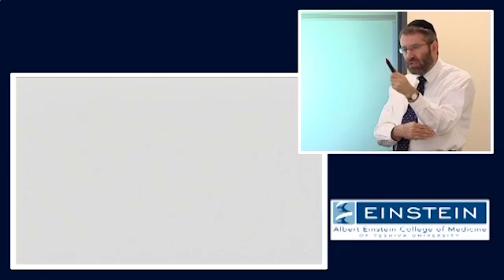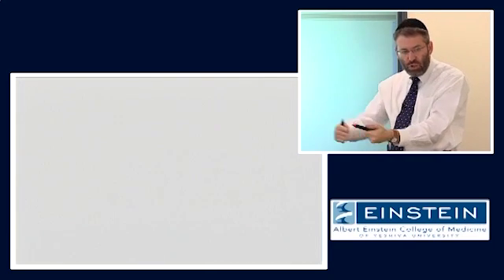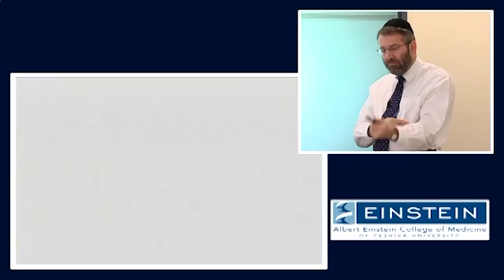Now, it turns out that if the TR is extremely long, in which situation will we have a higher steady state magnetization? When we rotate our magnetization 45 degrees, or when we rotate it 90 degrees? If the TR is extremely long, meaning we allow this to recover all the way after every TR. 45 will have a larger amount of transverse magnetization? No, less. Will have less, exactly. So my question was, which one will have a larger steady state signal? Right? So 90 degrees, when the TR is long, will give us a greater amount of steady state signal.